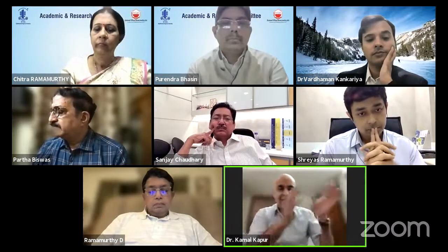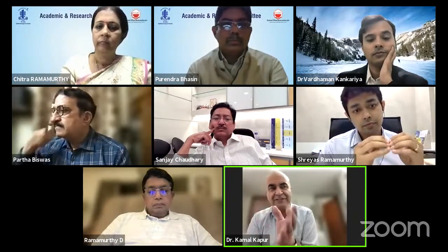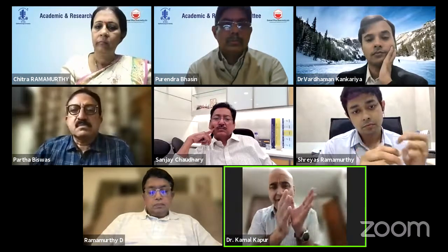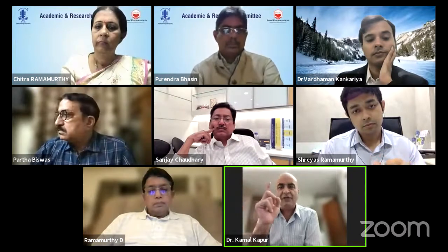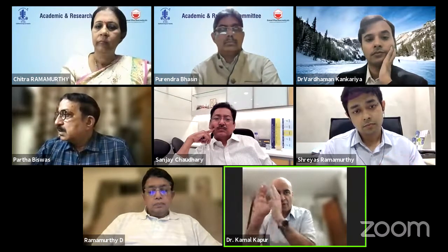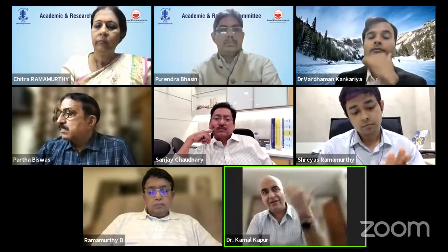Anaga, like your case, 11.3, 11.6, and 11.9, I would put this on Cirrus, and the Cirrus has a mode called manual edit. So you can zoom in on the picture, manually move on an infrared image to the perfect mid-limbal line on one edge, and then similarly on the other, and then see whether your reading varies.